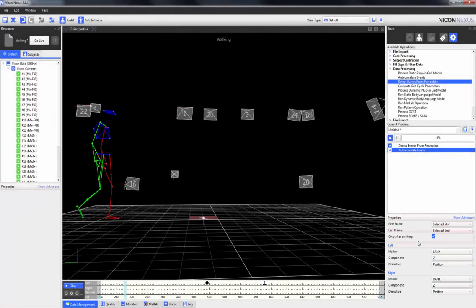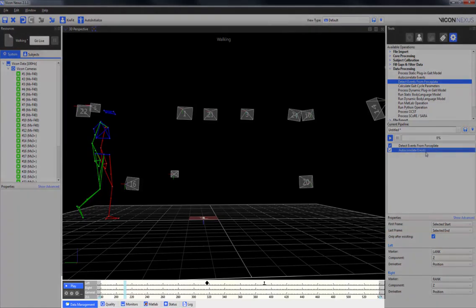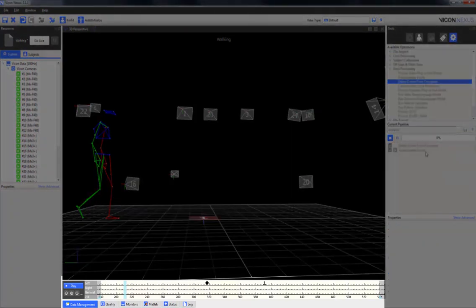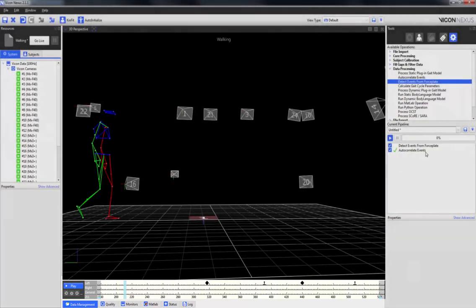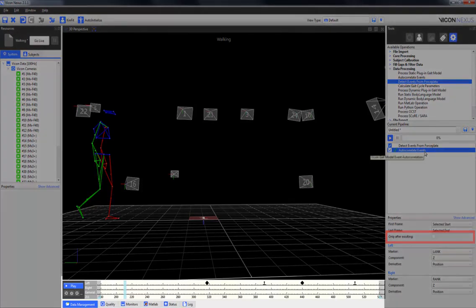Running this operation with the 'only after existing' box checked will result in events being placed only after existing events. Unchecking the box and running the operation will result in event markers being placed before as well.